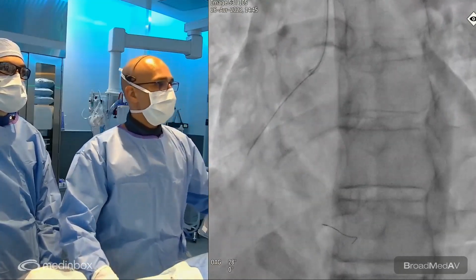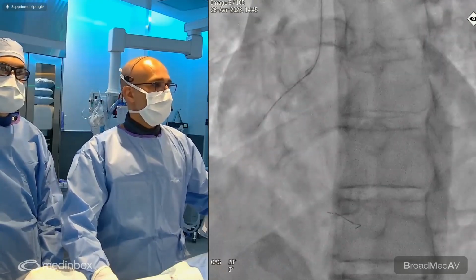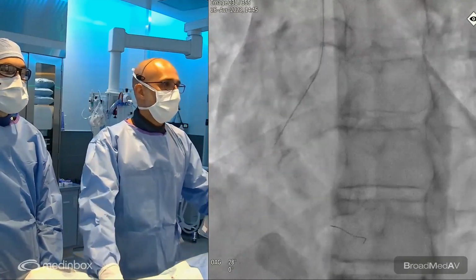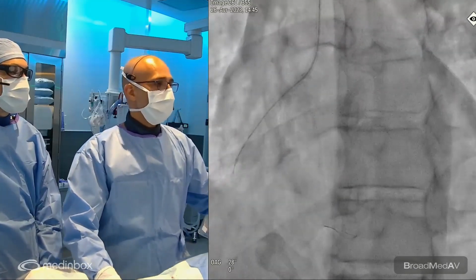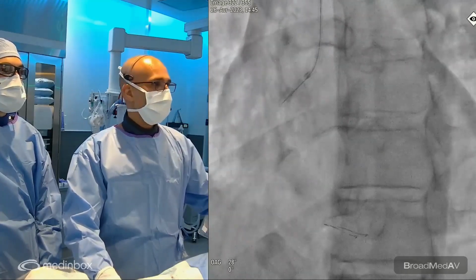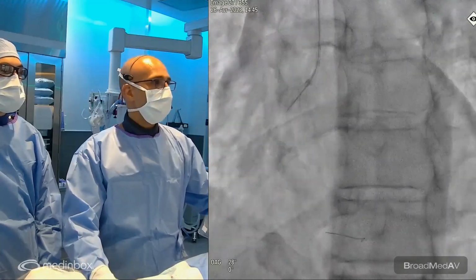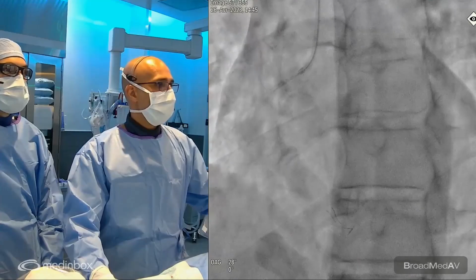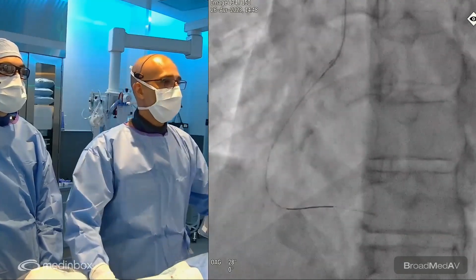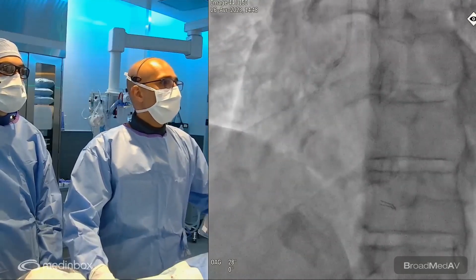I had some resistance in that mid lesion of the RCA, but still it went through. And I had a few episodes of bradycardia. So usually when you're doing atherectomy, if you do not have a pacemaker in place, you should limit yourself to 10 seconds of atherectomy and use vasodilators when needed. So following the atherectomy, we exchanged the wire for the workhorse wire, not to cause distal dissections. Next.